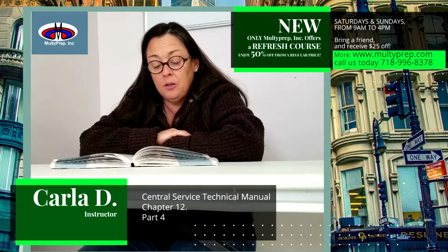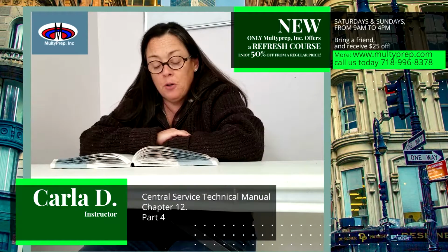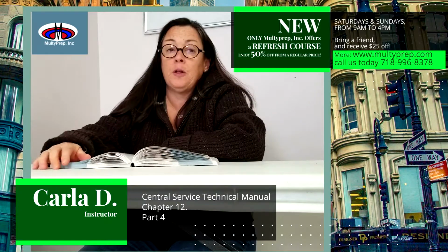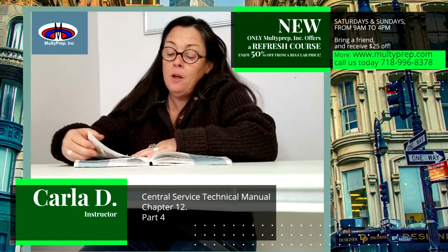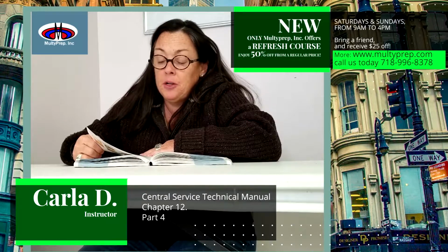If holes, punctures, or worn spots are discovered, the linen wrap must be repaired using a heat-sealed patch designed to cover the hole. The size of the flat surface area covered by heat-sealed patches on reusable fabric should be considered before the fabric is used. See 12.30 for an example. Reusable materials with approved heat-sealed patches can be effectively sterilized.